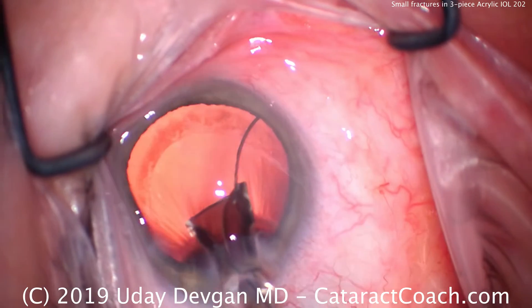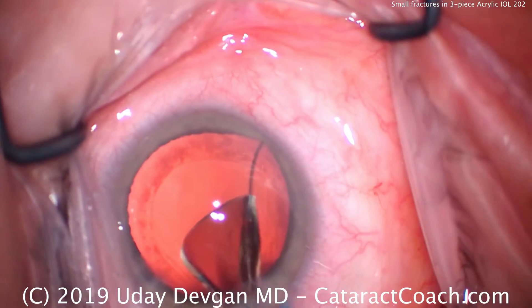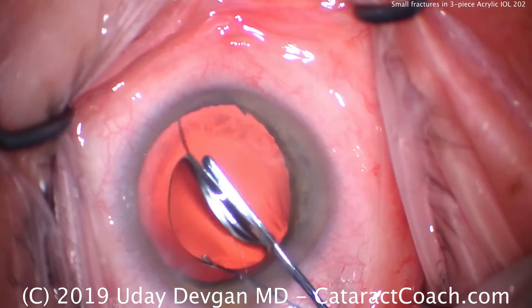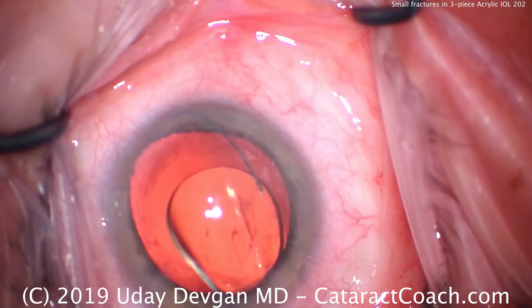What do you notice? The leading haptic's not in the correct orientation. Let's stop and fix that. So we'll go in here with that other instrument, put it into position — there we go. Just like that, we reposition the lens.